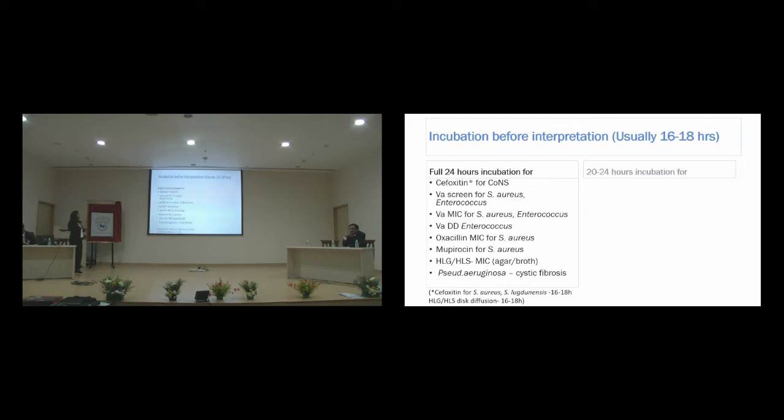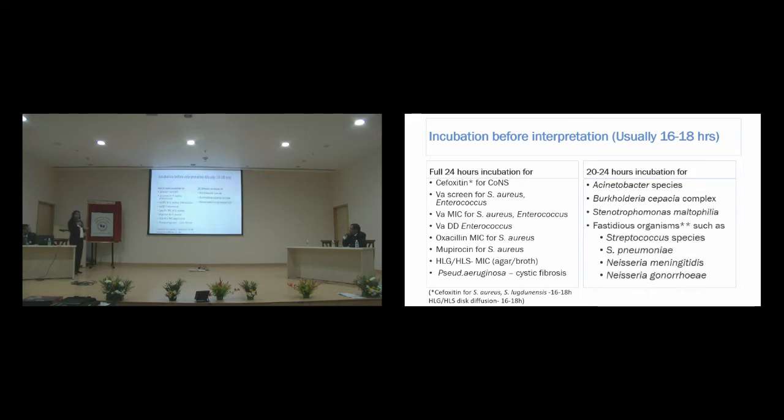Next, 20 to 24 hours of incubation is recommended in certain conditions: Acinetobacter species, Burkholderia cepacia complex, Stenotrophomonas maltophilia, and fastidious organisms, that is Streptococcus, Streptococcus pneumoniae, Neisseria meningitidis, Neisseria gonorrhoeae. In all these, the incubation has to be 20 to 24 hours. The exception in this list of fastidious organisms is Haemophilus influenzae. Otherwise, for all other organisms, the duration of incubation is as mentioned.